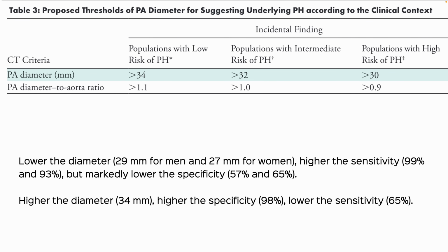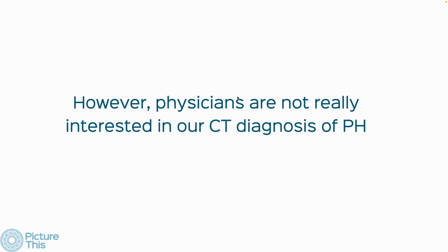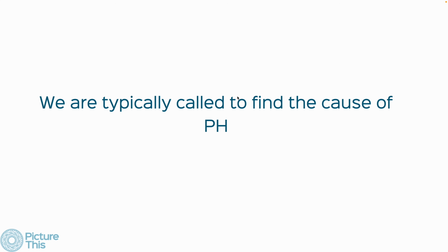Having said that, we don't need to split hairs. Just mention the diameter and leave it, because the physicians are not really interested in our CT diagnosis of PH. So we should mention it as part of the report in diffuse lung diseases, but otherwise it's fine.